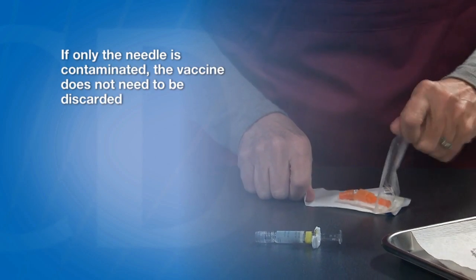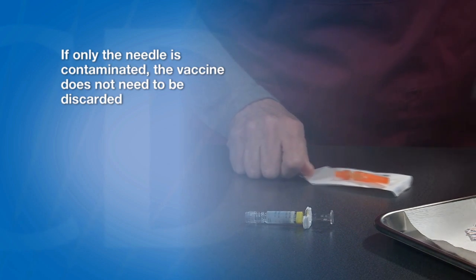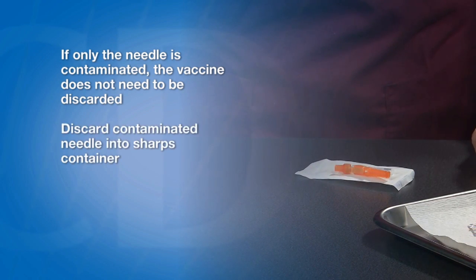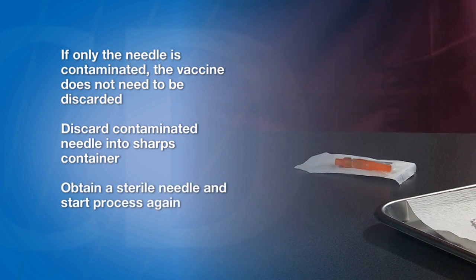If only the needle is contaminated, the vaccine does not need to be discarded. If the uncapped needle or a needle hub is touched or contaminated at any time, discard the needle into a sharps container. Obtain a new sterile needle and start the process again.